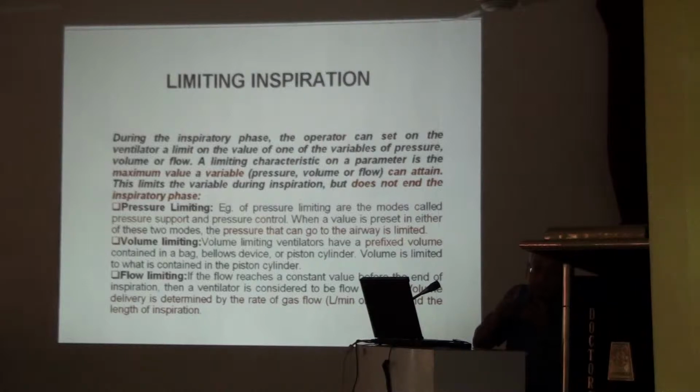And that has to be matched, that has to be plotted on the ROM and RAM. What is the difference between ROM and RAM? RAM plots the data picked up, and ROM has some inherent data impregnated or printed on it. That has to be matched, then only you can deliver this.